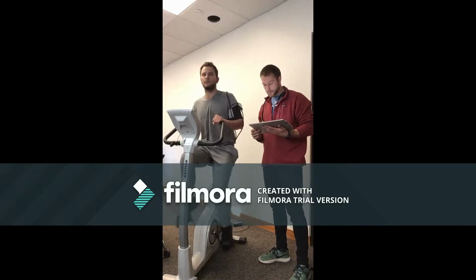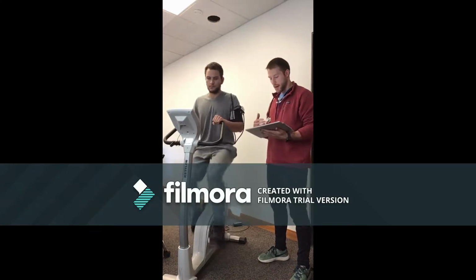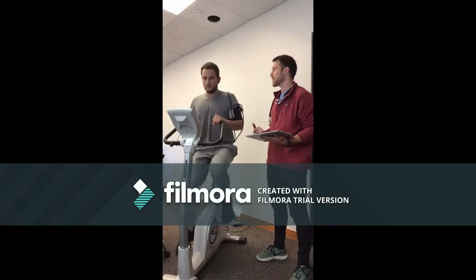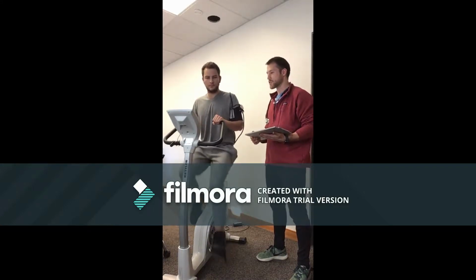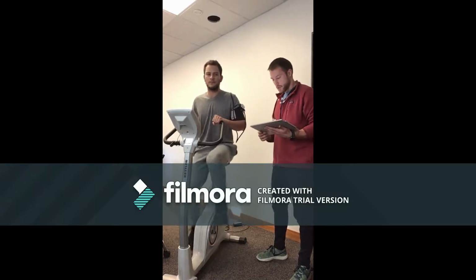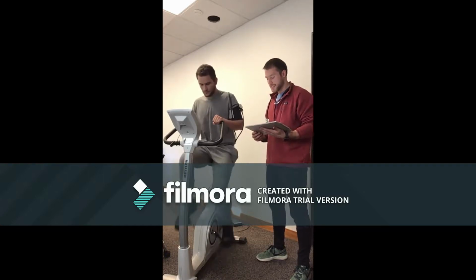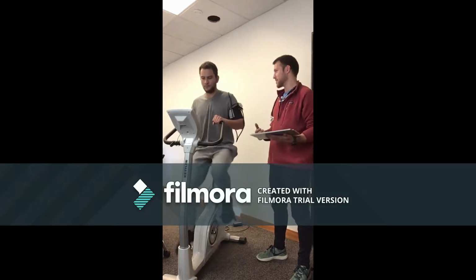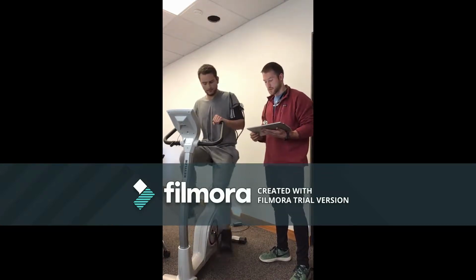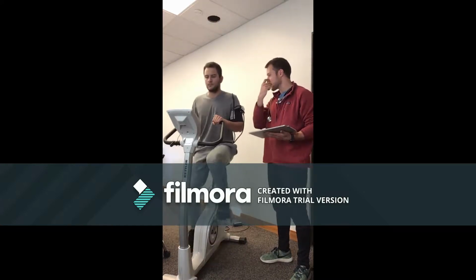So, just wanted to refresh you on what we did at the beginning. We had gone over your exercise history. You told me that you were participating in vigorous intensity exercise 4 days a week for over 20 minutes for over 3 months. And you also told me that you haven't had any cardiovascular disease, any metabolic disease, any renal disease, or any symptoms related to those. So we knew that it was going to be okay to exercise without getting medical clearance.